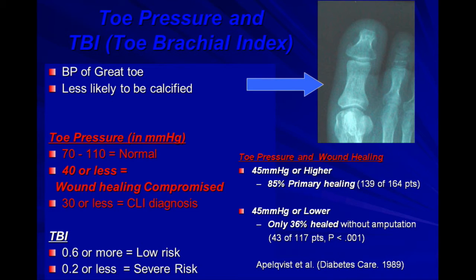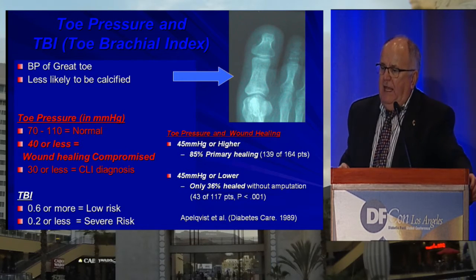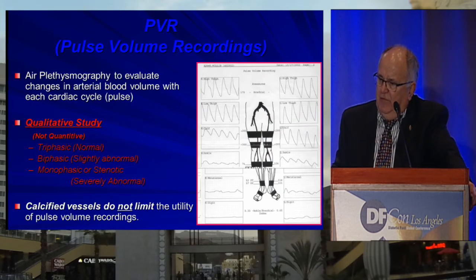This is what we do, is toe pressures, and previous speakers have talked about that. And again, 70 to 110, it should be a little bit less than the systolic pressure. At 40 or less, wound healing is compromised, and at 30 or less, we have the diagnosis that something has to be done as an intervention. So again, can you use those to predict healing? And I think what you've heard now is that these are one tool to decide: is there ischemia, does it correspond to your clinical evaluation, and does that patient need to be further investigated?